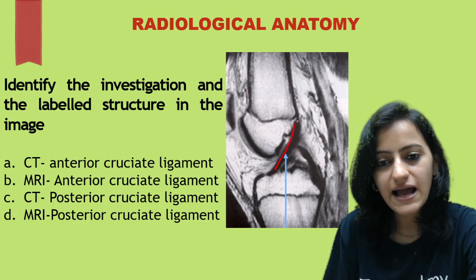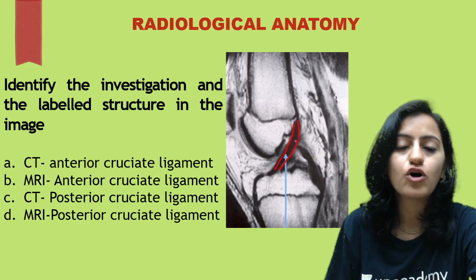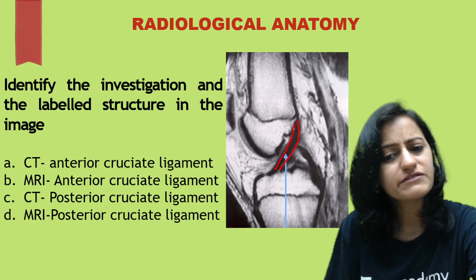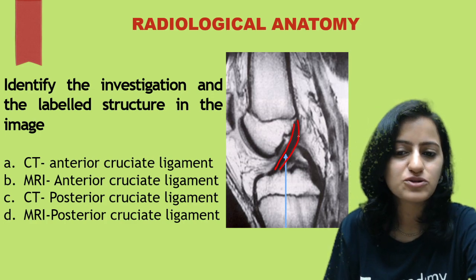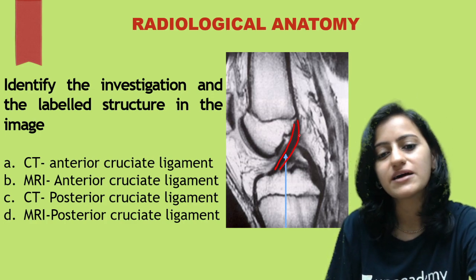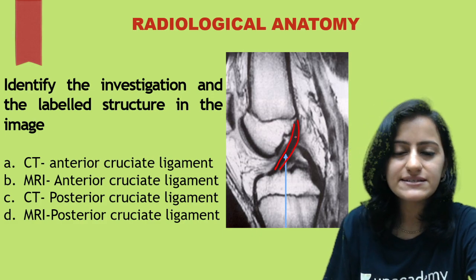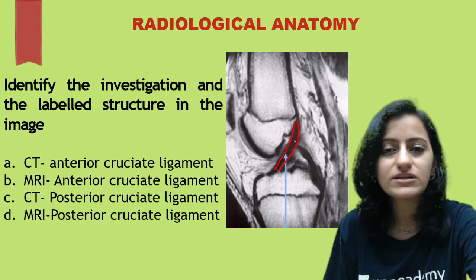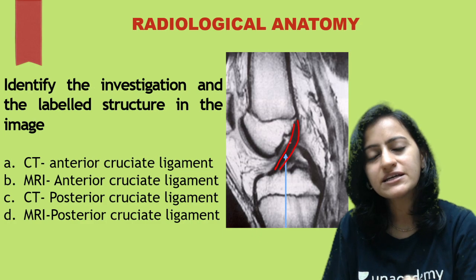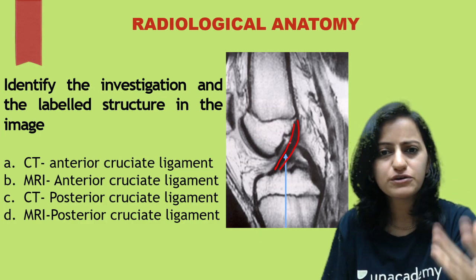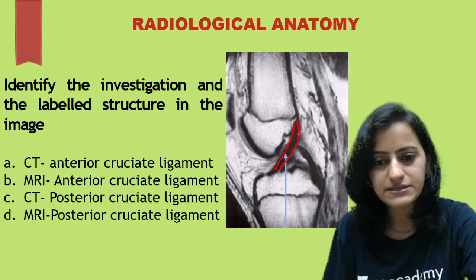This is the anterior cruciate ligament — a normal one — which is black, dark, and hypointense. A normal ligament is hypointense. When there is degeneration or a tear, we see hyperintensity due to fluid coming in, which gives that hyperintense signal.